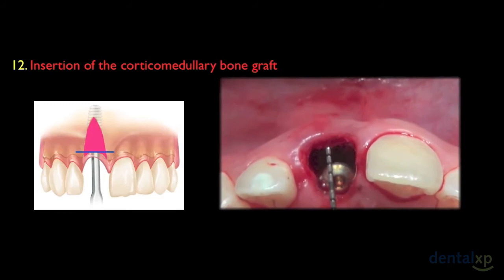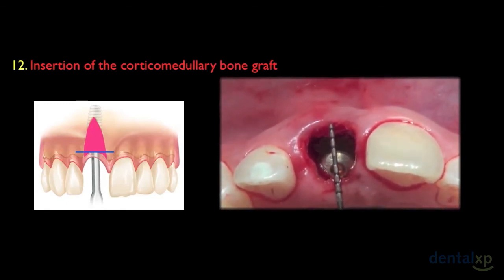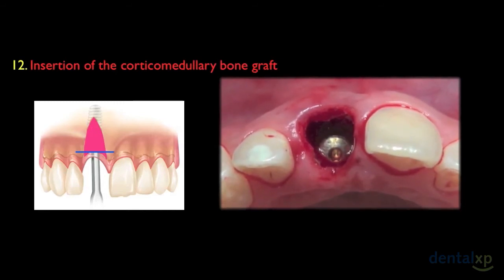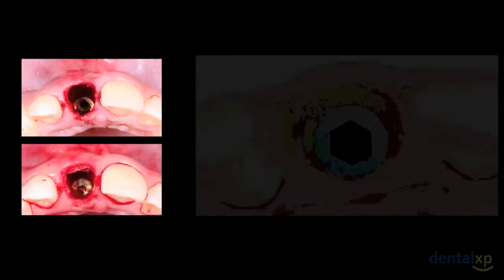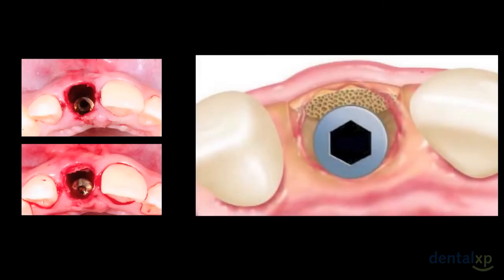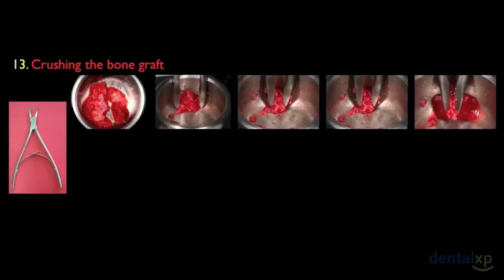Here we are measuring the gap to be filled after insertion of the corticomedullary graft. When the bone graft is left loose behind the soft tissue, we could compromise the result — the tighter it is introduced, the better the result. Here you can see the defect before and after insertion of the corticomedullary graft. Take a look at the juxtaposition of the graft into the defect.